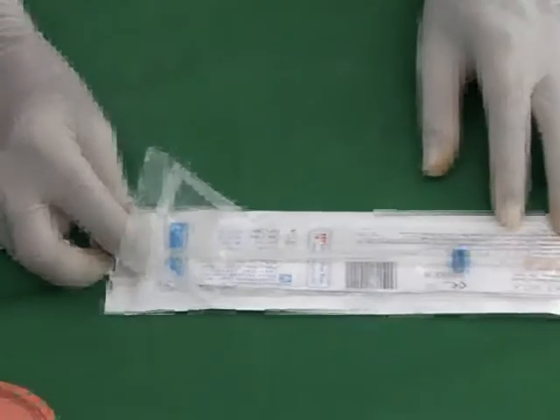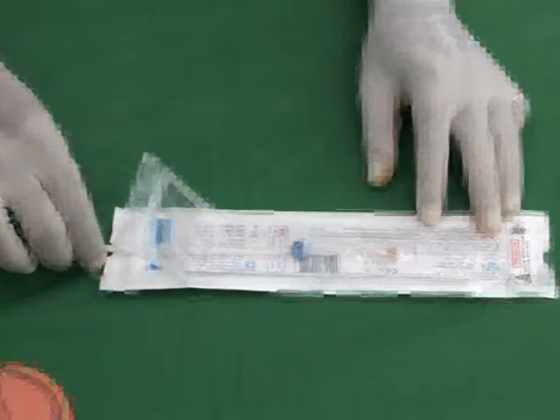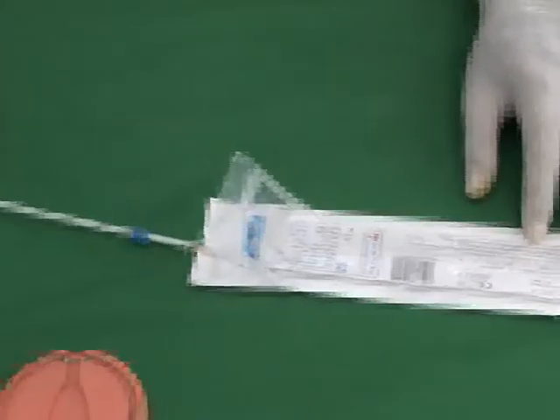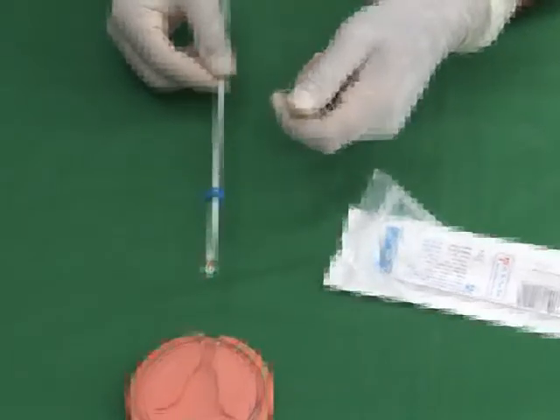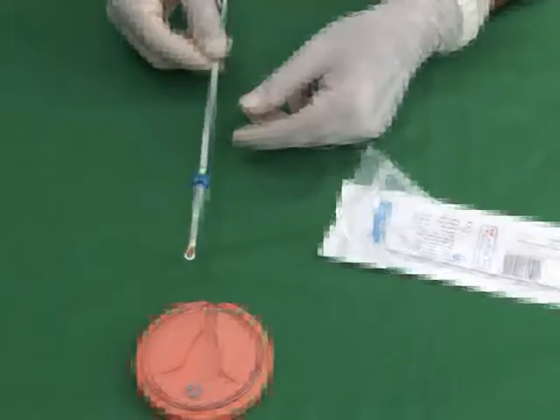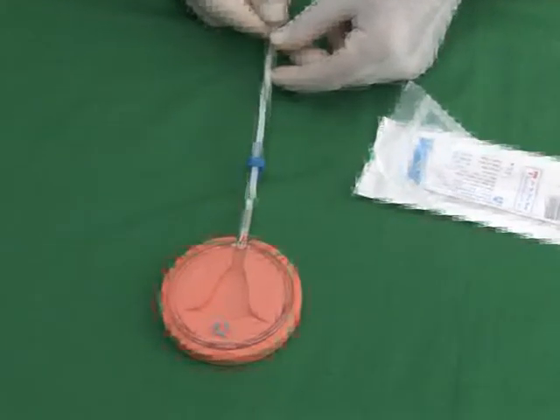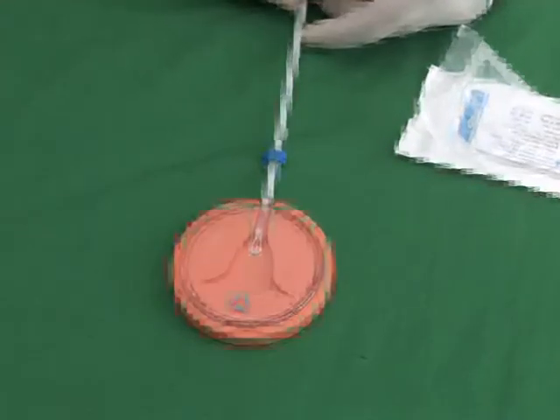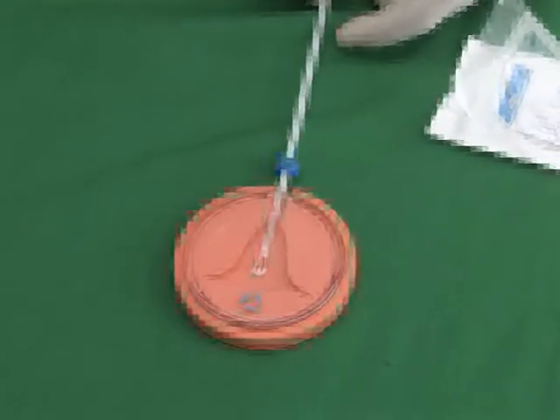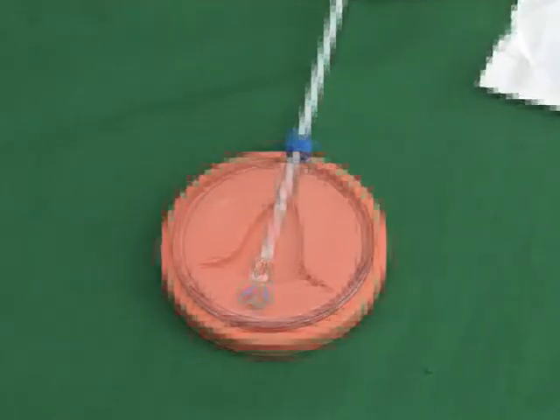Let me now demonstrate the insertion of the intrauterine contraceptive device. You need to take the device from the package and then stabilize the uterus by holding the cervix with a tenaculum. Then you introduce the intrauterine device through the cervical canal and advance it towards the uterine fundus up to a point where the blue movable part comes into contact with the cervix.